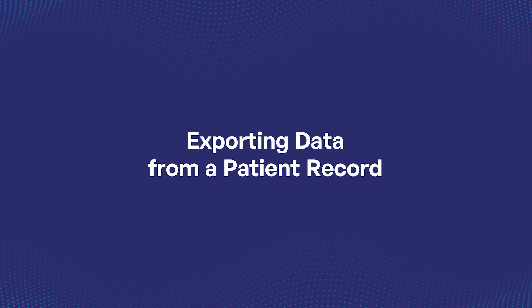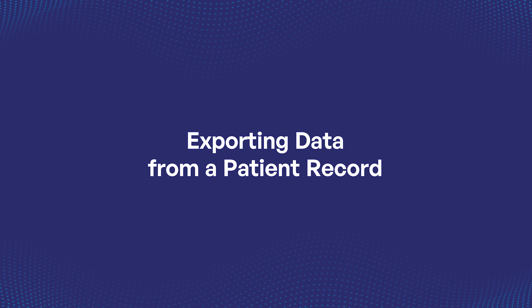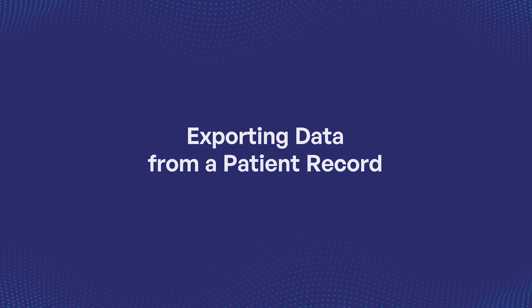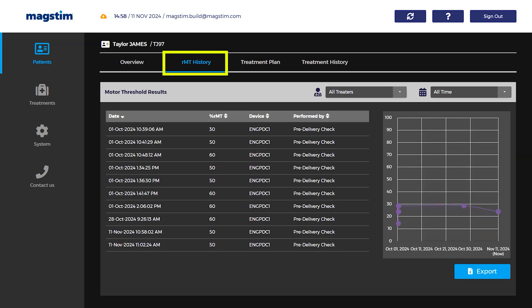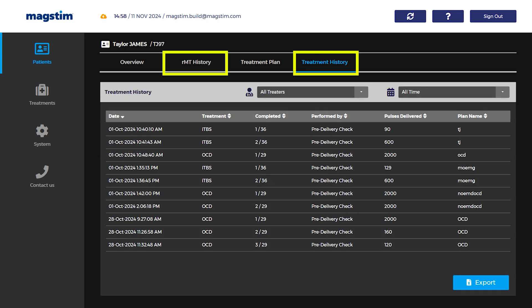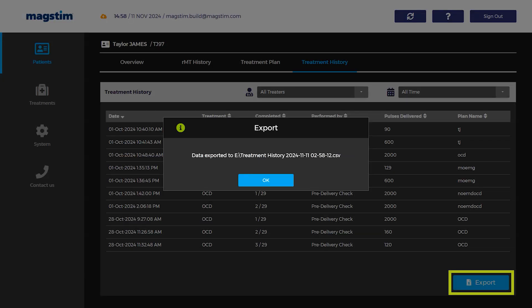Exporting data from a patient record: Motor threshold and treatment data can be exported. On the patient record, select either the RMT history tab or treatment history tab and select export. A removable drive must be inserted to export data.